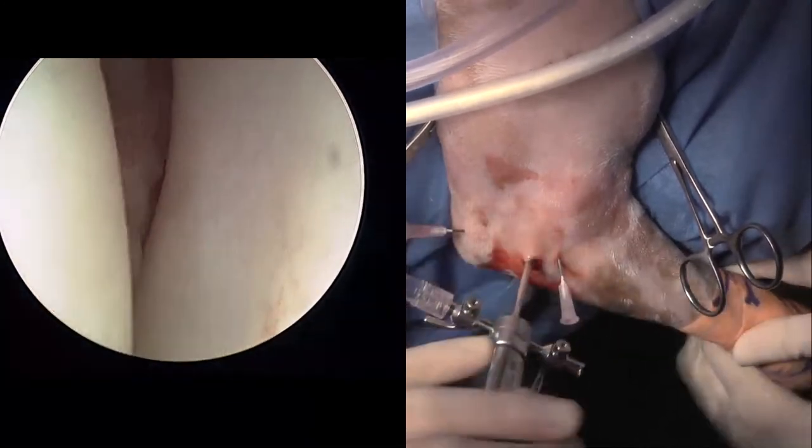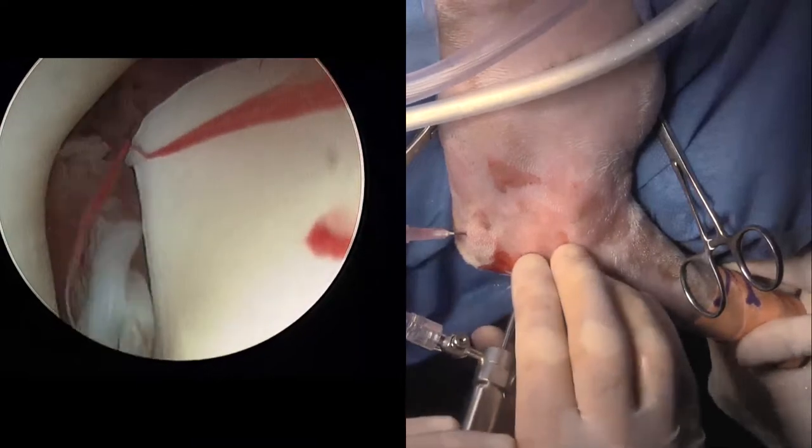Saline is on, that one's off, connect our camera. So this is another 2.3, and that is heaps better. Look how much clearer that is.